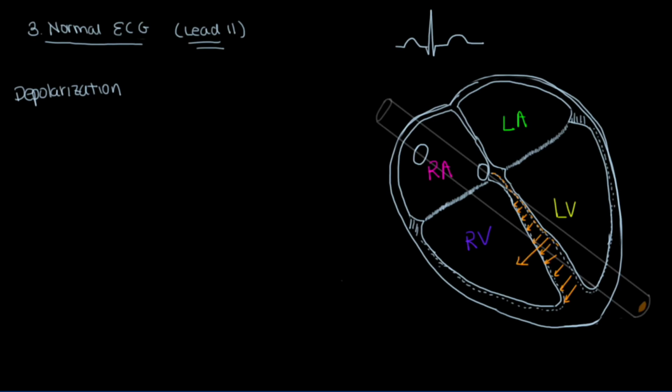And it may be a little bit hard to see how that overall charge is moving relative to the lead that we have here. So I'm going to just draw it again here. Okay. It's down this way with the sensor down here. And the overall charge is moving in that direction. So when you break down this positive charge's direction into its components that are perpendicular to this lead and parallel to this lead, you'll find that the perpendicular element is something along like this, right?